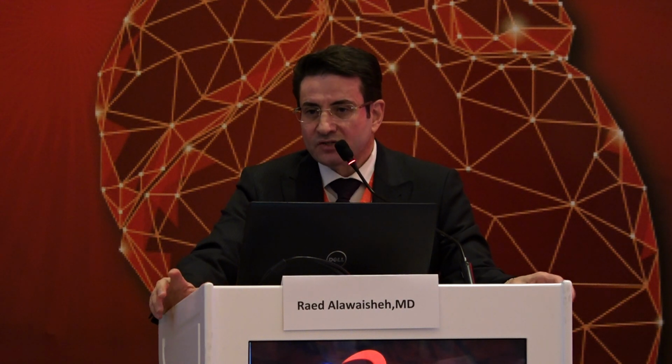And CT is very important to do as a strategy, but it is not usual. Even by the guidelines in CTO, going with CT is not a class 1 recommendation, it's a class 2 recommendation. Doing the CT, in some cases, when you have a long segment of occlusion, and especially if you want to stage the cases, yes, definitely CT will be important. But if you are a CTO operator and you find that you have a CTO and it is the only one to blame, with no other culprit lesion, and you want to start with it, and you don't have CT, you go ahead and do it.